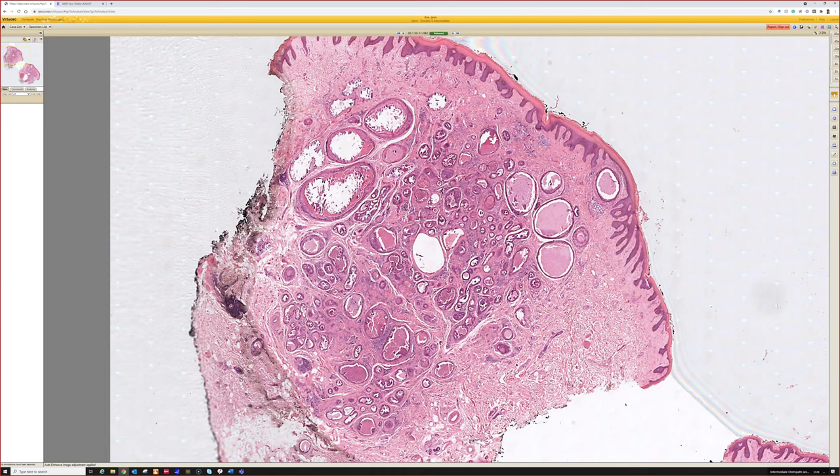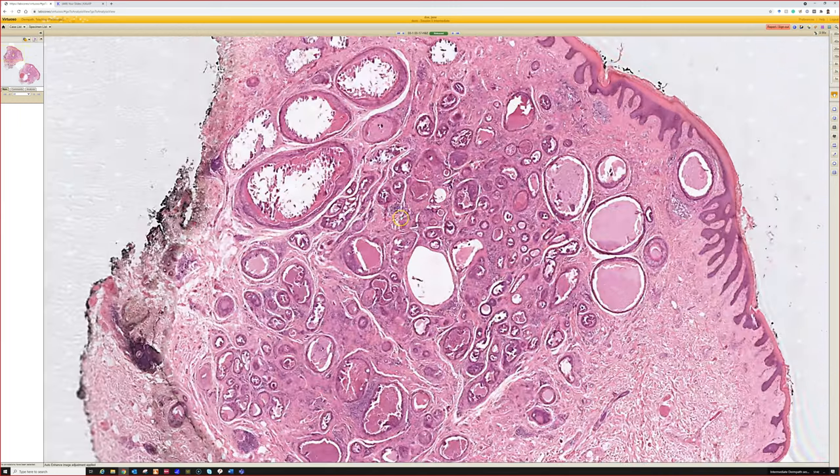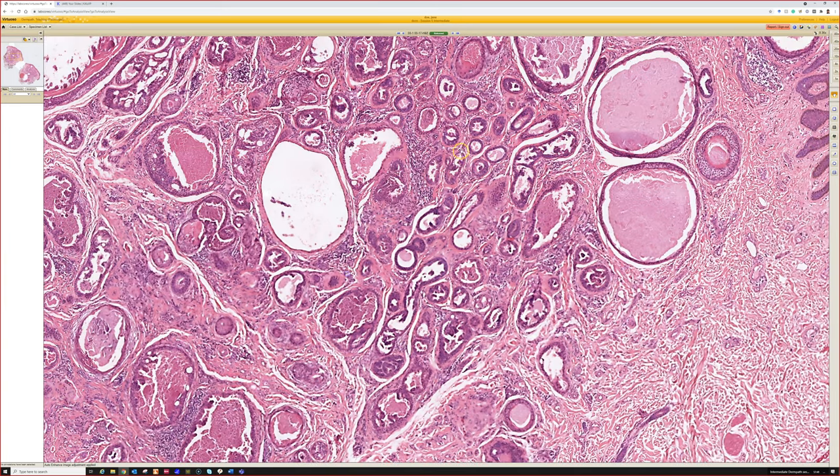Yeah, papillary eccrine adenoma or tubular apocrine adenoma. People split these out, but I still do not know reliably how to tell them apart. I'll tell you the honest truth. This is labeled, I believe, as a tubular apocrine adenoma, but it also has a lot of little papillae in it, right, that look a lot like papillary eccrine adenoma. So I think these things probably exist on a spectrum.